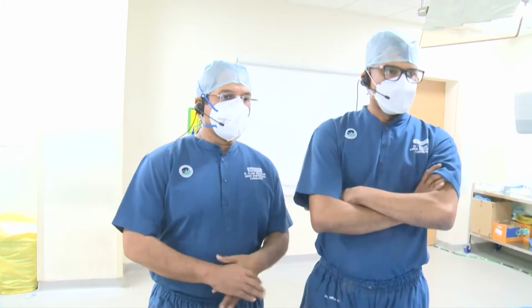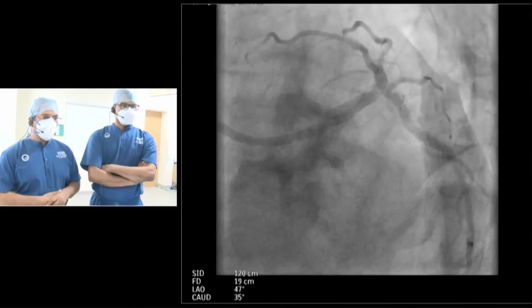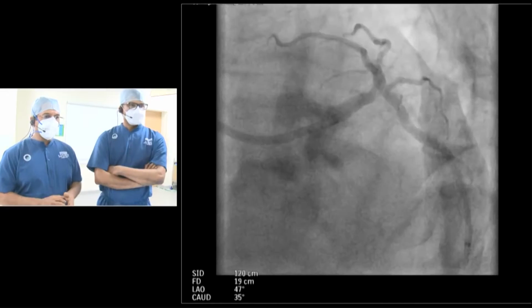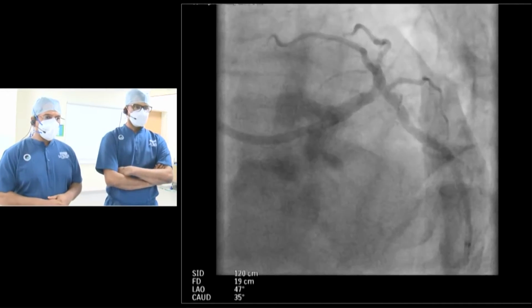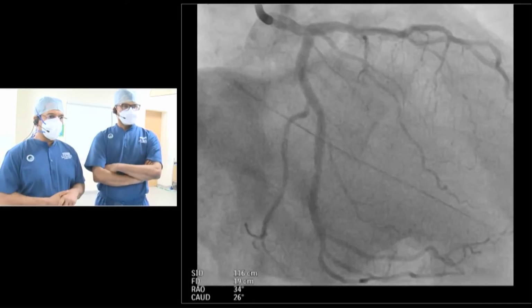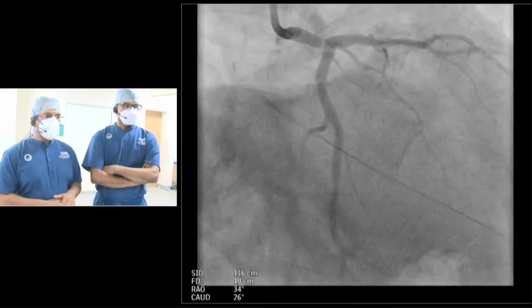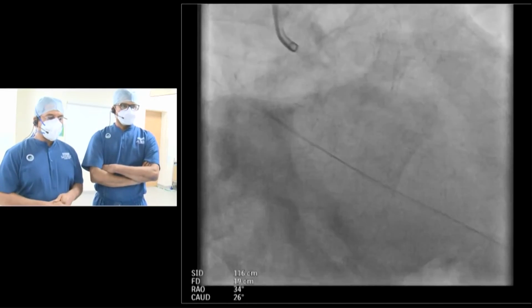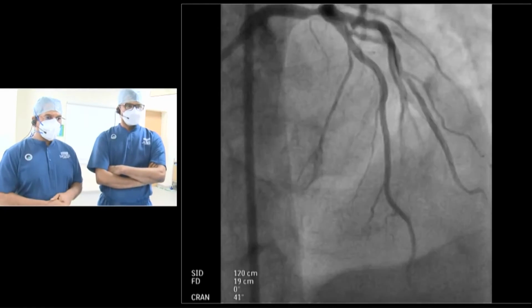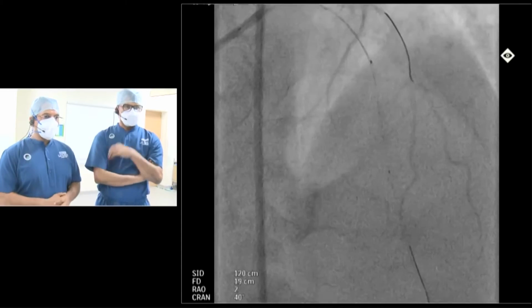Yeah, thank you, Umeshan. So the difficulty we had was the angiography. We are not very sure about the circumflex ostium and the ostium of the LAD, whether to address that, whether to go for provisional stenting from left main to LAD and then see how the circumflex is, or do an image-guided angioplasty. So what we did was we first did a pre-procedure OCT run from LAD into the left main.